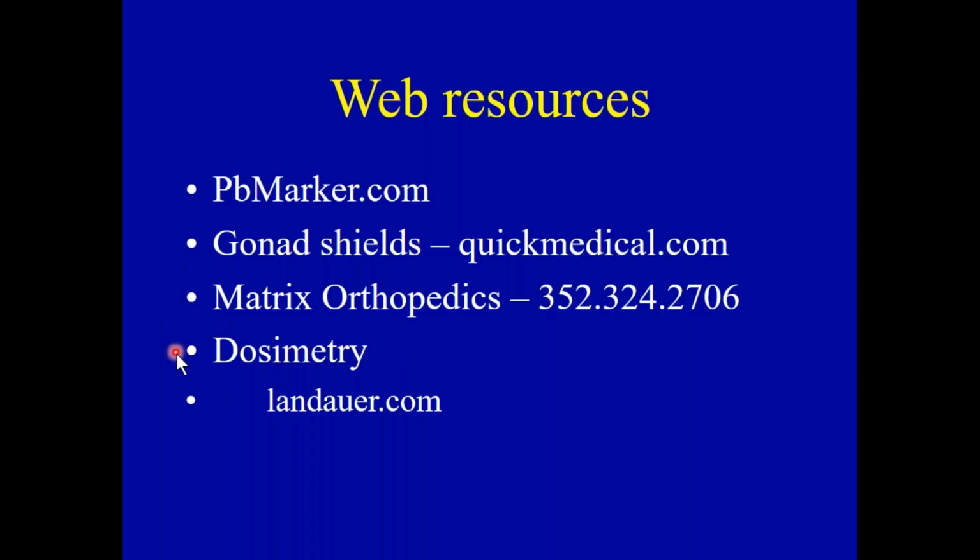And dosimetry, this is speaking about film badges. There's all kinds of film badge companies out there. They will give you a quote. If you're paying more than $150 for the film badges and the service, whether it's quarterly, monthly, whatever, you're paying too much. So ask some other people what they're paying. You should have a film badge for every individual in your office, and there needs to be a control badge at the front that should measure 0000 every time, because that's the control comparison.